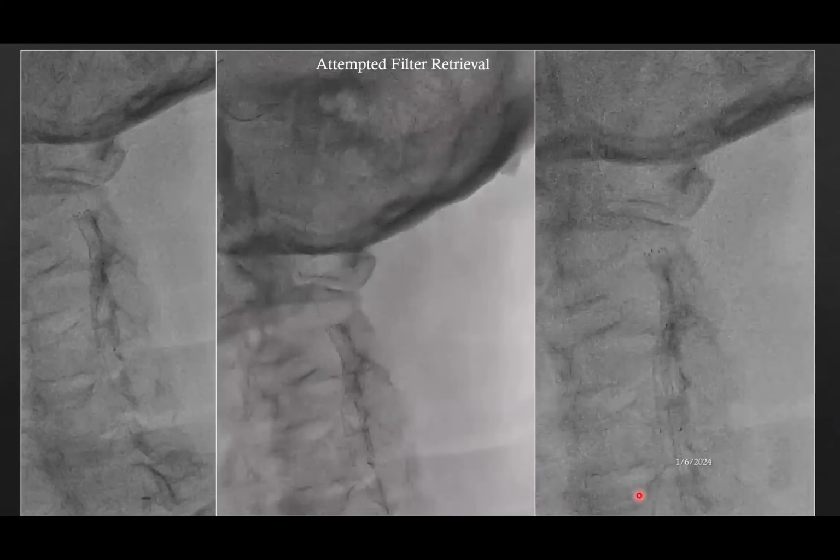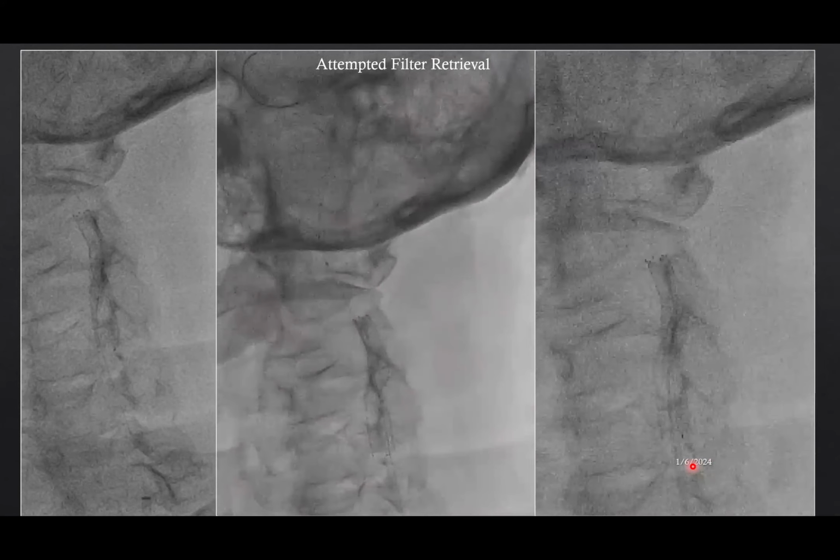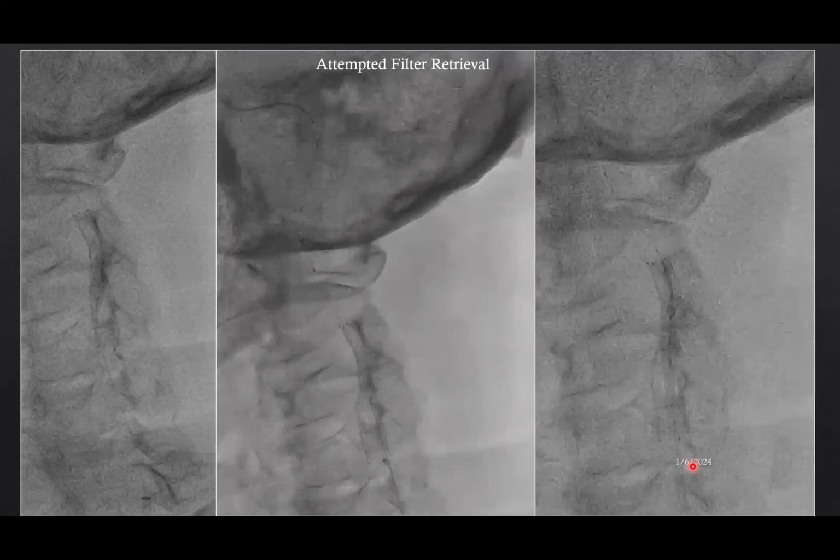What we did was first take a curved guide catheter, a 7 French Judkins right, or right coronary guide catheter. We navigated it slowly into the stent, and once it was closer to the site of the stenosis, a balloon was passed across this guide catheter.